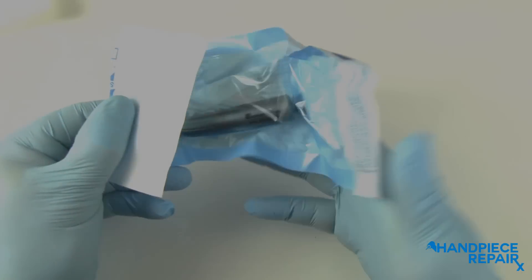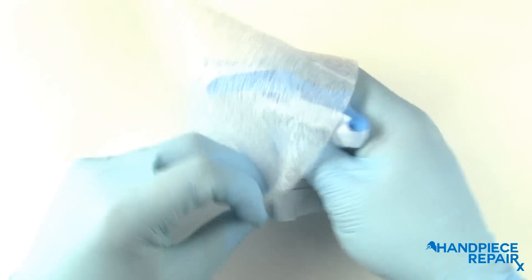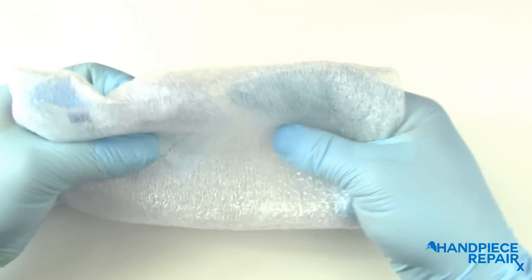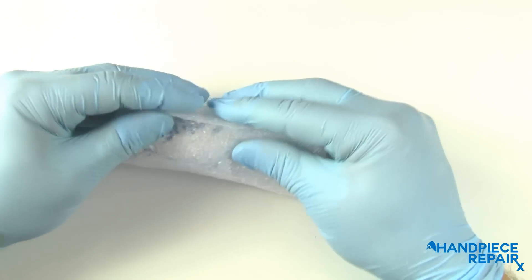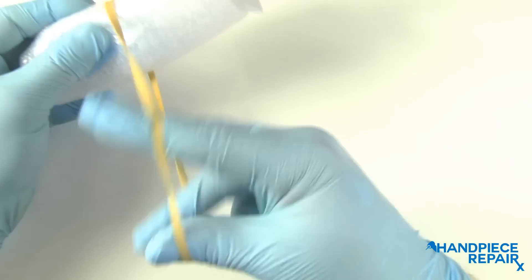Now take your autoclaved hand piece and roll it into the foam sleeve. You can secure this with a rubber band or tape.